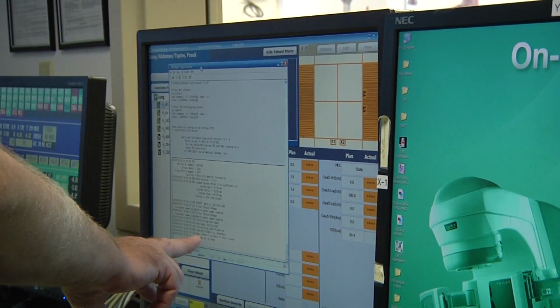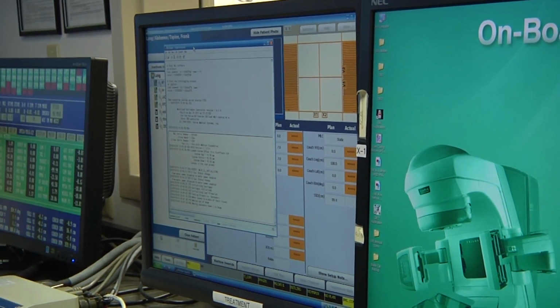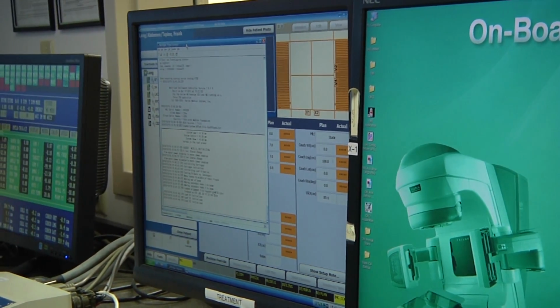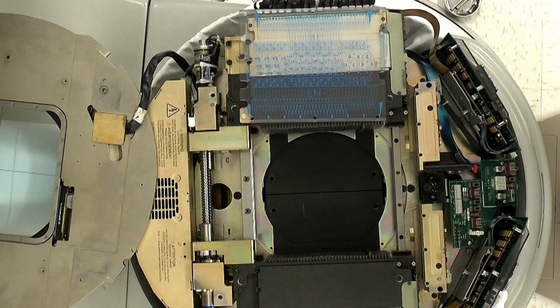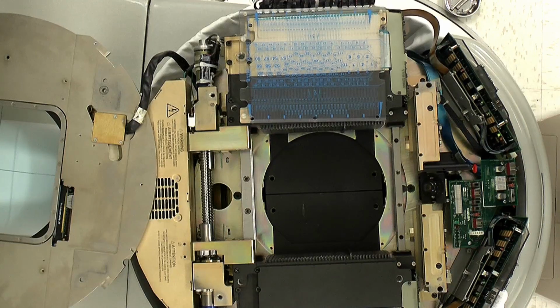Okay, down here it says moving out of beam. So that's that optical beam that it's looking at. And now it's going to go through leaf pairs, and it's going to go through each of the leaf pairs. It's going to break that beam and retract. And that's going to tell the MLC exactly what position those leaves are at. And it takes twice as long if you're watching it.